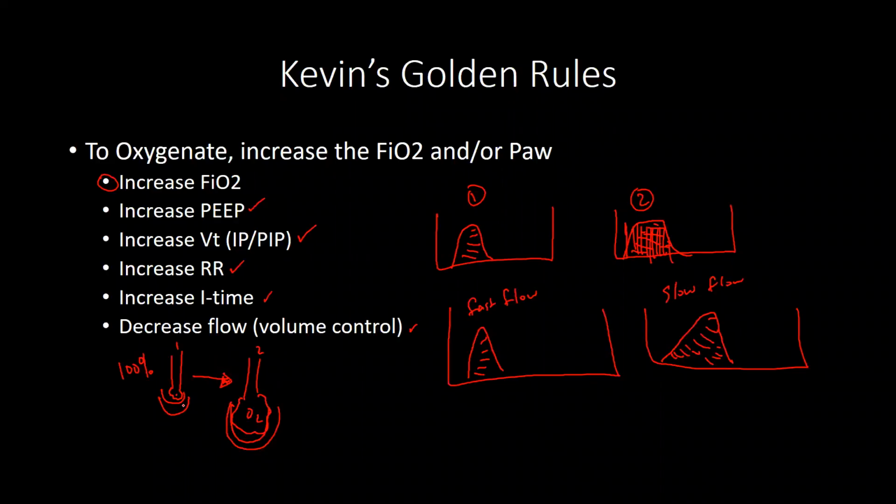Yeah, we wouldn't want to do that, because remember, with your ventilator, you're going to go up to 60% FiO2, and if you're still hypoxic, then you're going to increase your PEEP. And that's why you're going to increase your mean airway pressure, which is going to open up your alveoli more. Right. Okay.